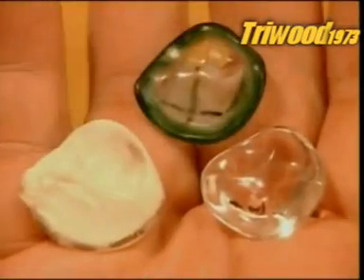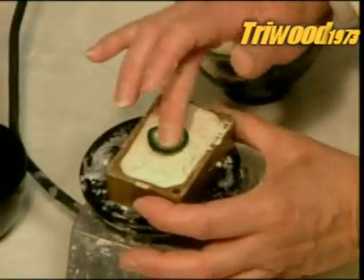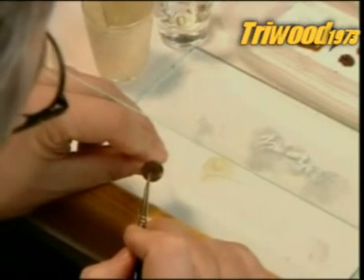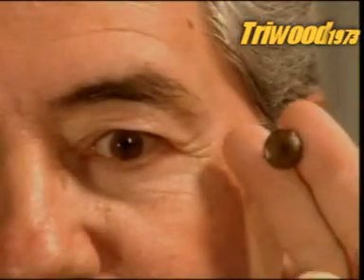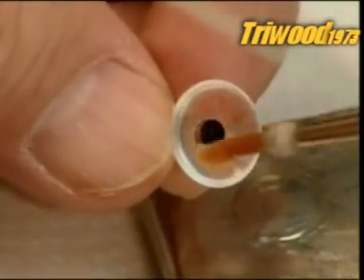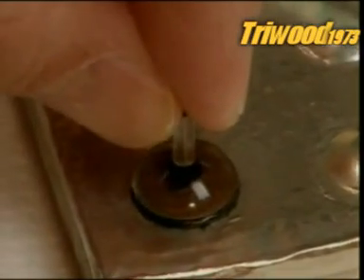Now they take this marked and enlarged fitting shape and make a plaster mould. Later, they'll use that mould to cast the actual artificial eye. But first, they have to make the iris. They take a curved black acrylic disc and paint it as realistically as possible with high-quality artist oils. The patient has to be present so they can match the real eye. Next, they glue an acrylic cornea, with an appropriately sized pupil, onto the painted iris.